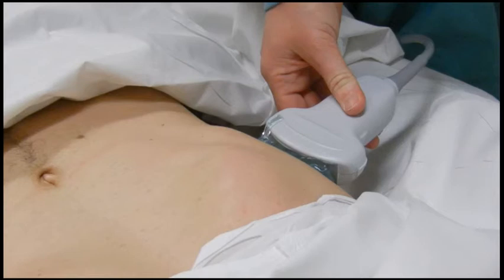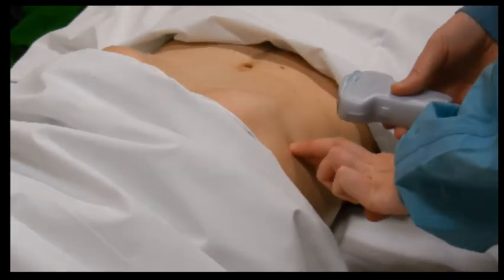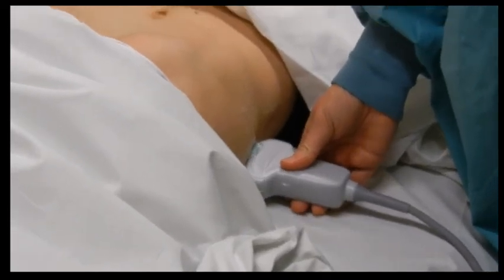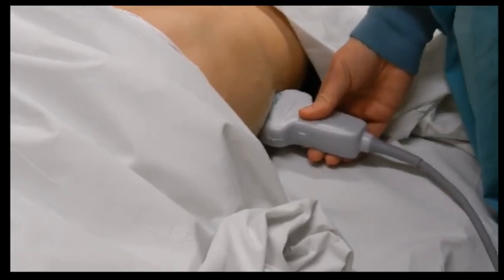As this scan is done in the longitudinal plane, the probe marker will always be towards the patient's head. Remember to keep your hand balanced and always move in only one plane at a time. To locate the radiographic landmark, the double density of the kidney, move the probe first posteriorly towards the stretcher. Remember, the kidney is a retroperitoneal structure and is most likely more posterior than you think it is. Don't give up until the probe hits the stretcher, or keep going until the probe hits the dirt, as we like to say. If the radiographic landmark is still not identified, then move longitudinally towards the patient's head or feet to try to find the best view of the kidney.